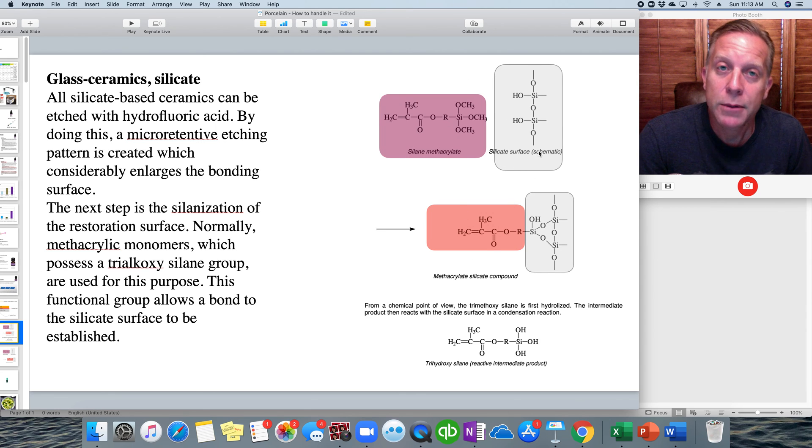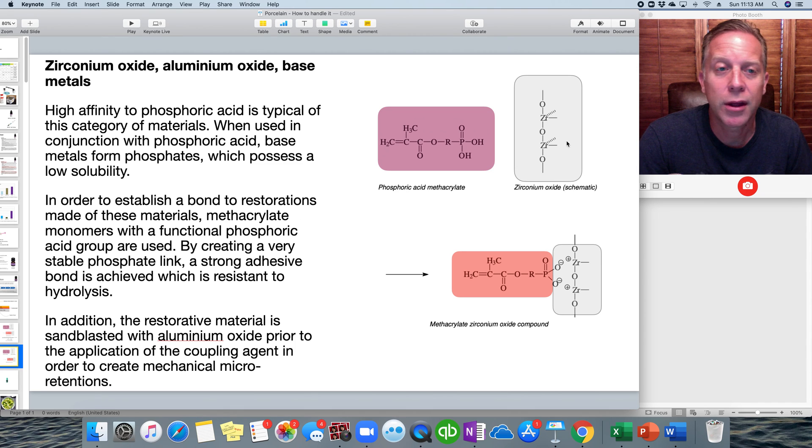Chemically, with a silicate surface like Emax or other porcelain, the silane methacrylate in Monobond Plus bonds to that surface and creates an active surface that attracts and holds onto whatever cement you place. Similarly, with a zirconia crown like a Bruxer, coating the interior with Monobond Plus creates an active surface that bonds well to whichever cement you use.